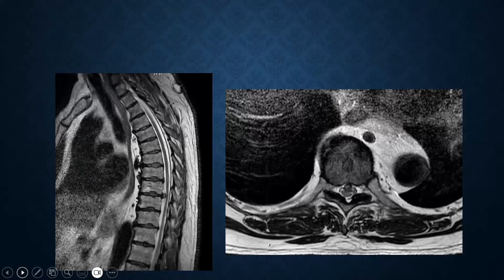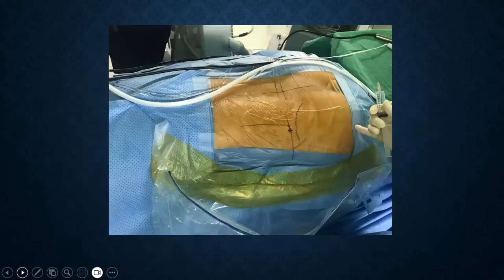Now, as I've gotten a lot more comfortable, all these patients I give a shot with the endoscope, because worst case scenario, you core this thing out and either it devascularizes and dies over time, or it makes your open approach easier because it gives you the space to mallet the offending disc into the cavity that you created with the endoscope. So either way, it works best to start with endoscopy in these cases, in my opinion.